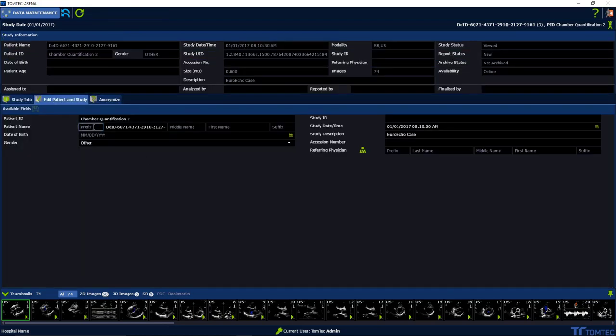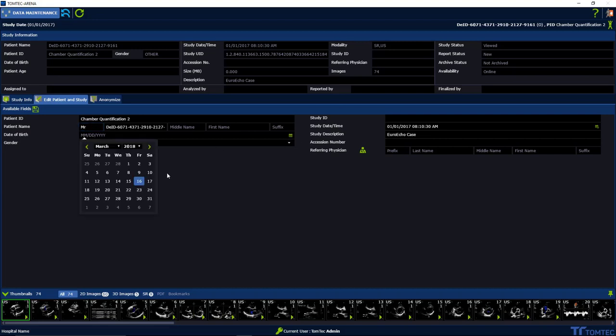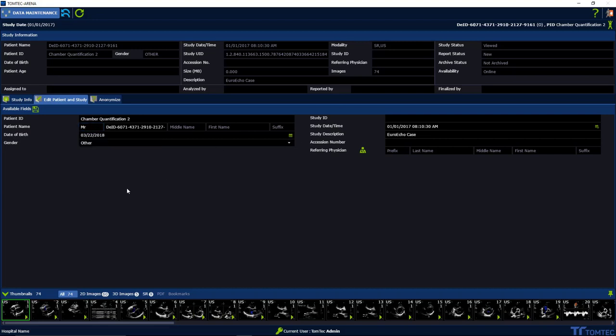Edit the patient name and gender, as well as the date of birth by using the date picker. Please save the changes here.